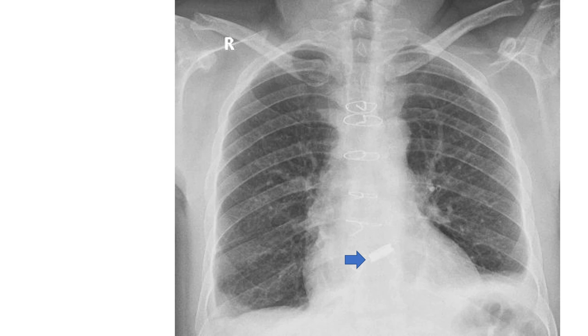The left dome of the diaphragm is slightly elevated compared to the right, though normally the right dome is at a higher level than the left.